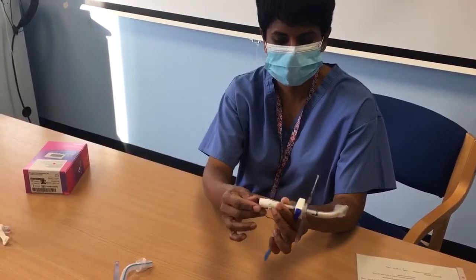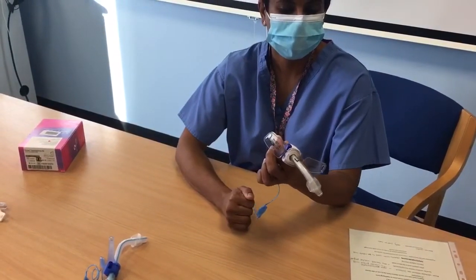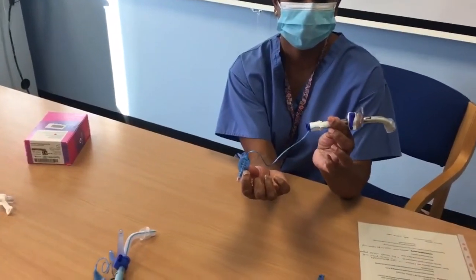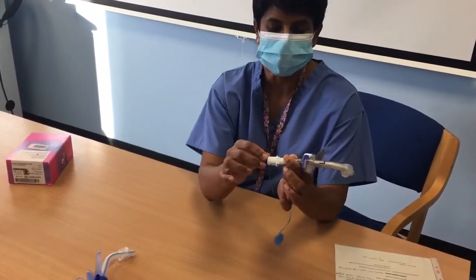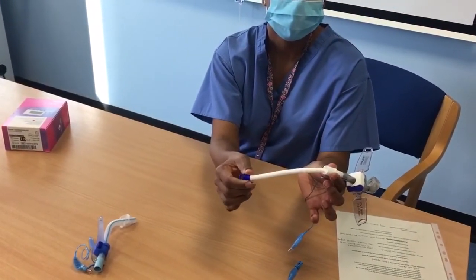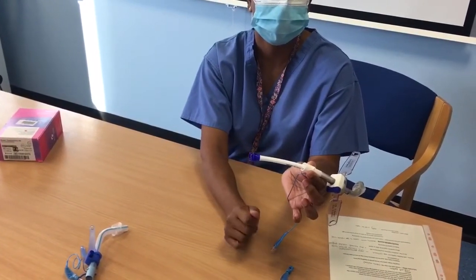Okay, so as you can see, this has a cuff which will create a good seal for ventilation, and our pilot balloon which will tell us again the size of our tracheostomy tube. This one has an inner tube. So if there are secretions, that's an issue, then we're able to suction our patient and change our tube, make sure it's clean.